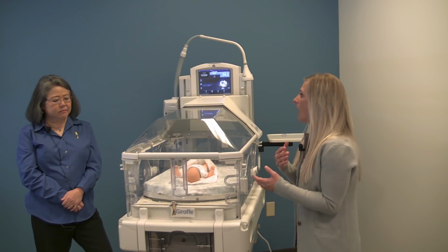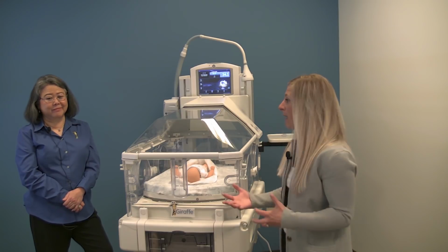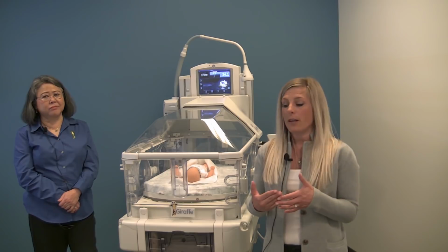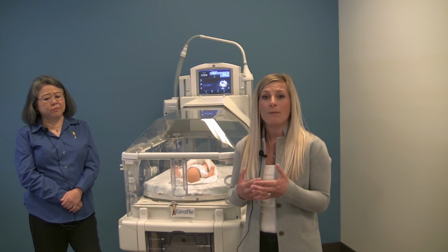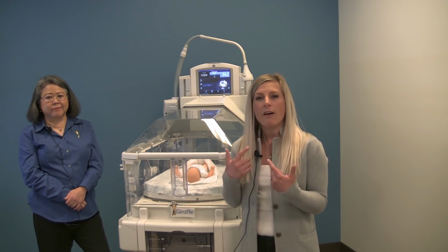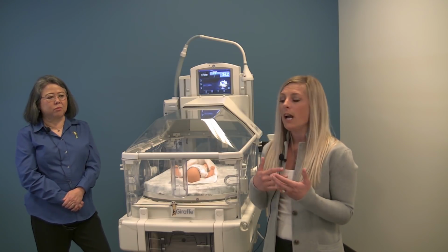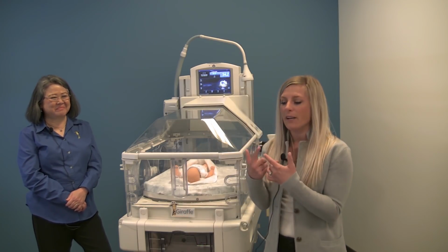So that covers the parent part. And then the other question was the eye patches and the shifting. As we've addressed, babies move around a lot, and so in-room phototherapy in a baby-friendly hospital will be no different. The added bonus though is that you've got mom who is a constant teammate and advocate for that baby. They'll have their eyes on the baby's eyes and they can help you out. Whereas in a nursery or a NICU, you may not stare at that baby all the time, I can promise a new mom's probably staring at that baby most of the time. So they'll be your eyes and ears.